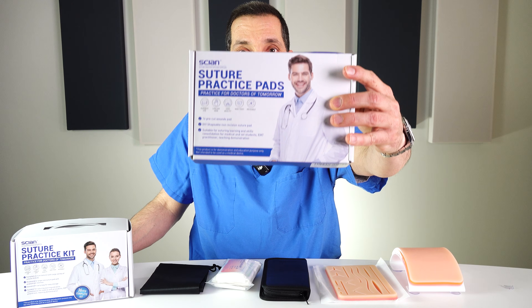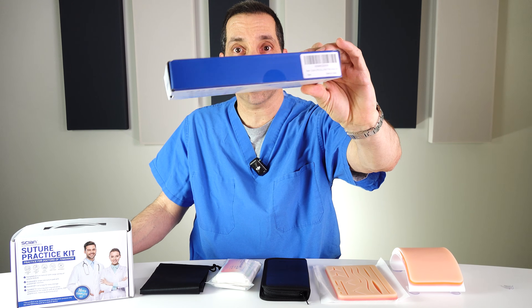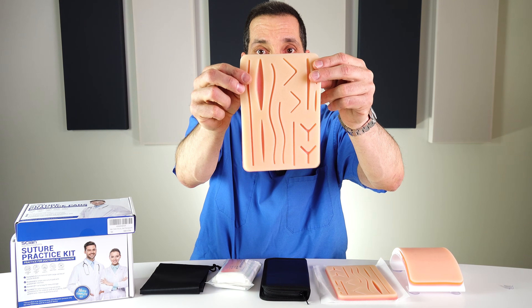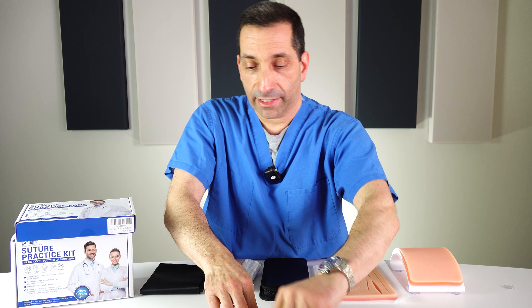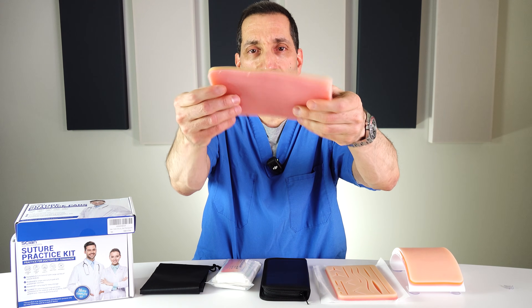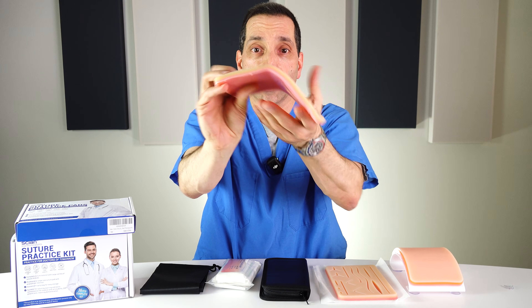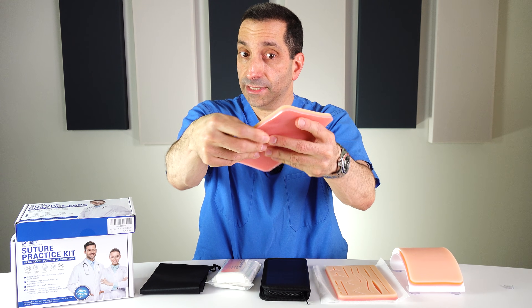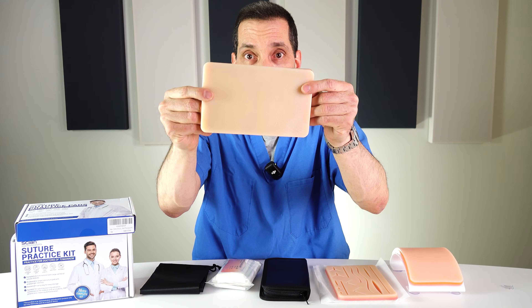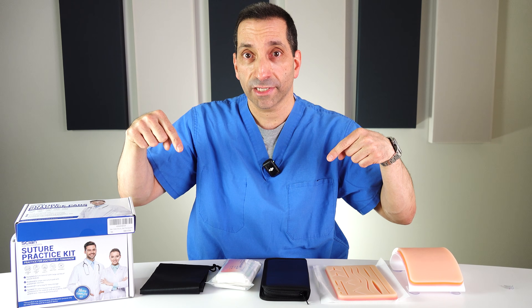There's also a smaller kit. If you already have instruments, this one comes with just two pads for $10.91 — link down below. It includes the same 14 pre-cut wound pad and also a flat uncut pad that has a wire mesh inside, so while it comes flat, you can bend it to different shapes to practice suturing on curved surfaces, since people cut themselves in the most inconvenient places.